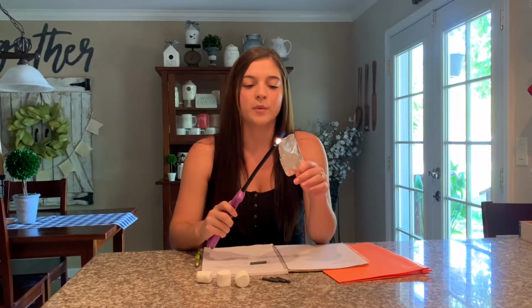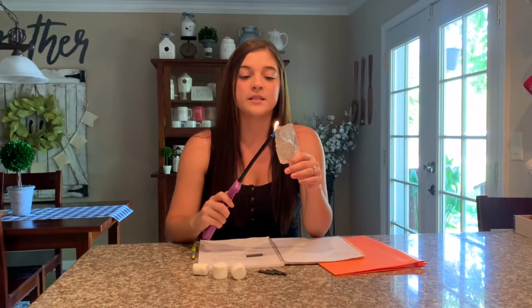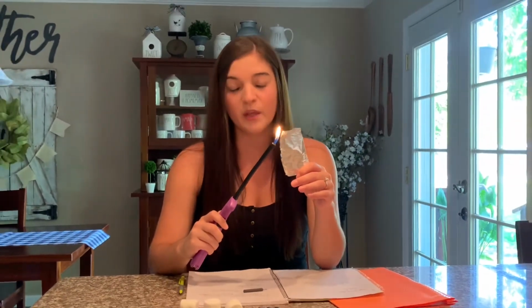If we were to use aluminum, you can already see that it is melting. Aluminum's melting point is only 1,221 degrees Fahrenheit. Aluminum is already melting. Now, if we were to compare it with tungsten, you can hold this fire on here for a very long time and it won't melt. Now, if we have a marshmallow here, which is of course what we wouldn't use, this marshmallow instantly starts to melt. After this experiment, we saw that aluminum and the marshmallow completely started to melt, whereas after a few minutes, there was no reaction with the tungsten. This is why we would use tungsten in our X-ray tube.